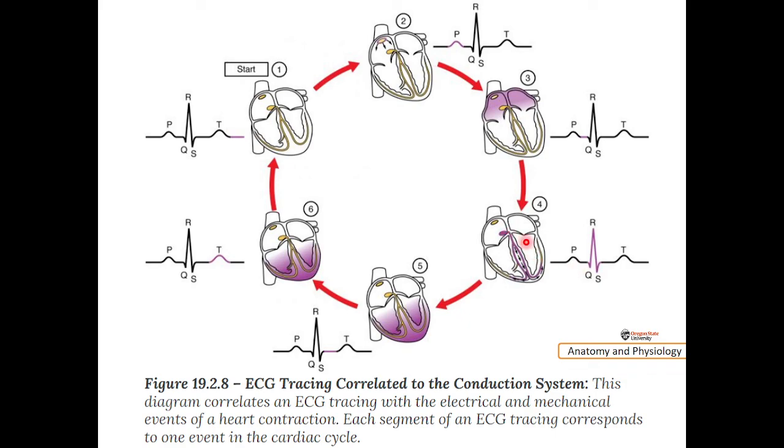After that comes the QRS complex. The wave of depolarization will come here, away from the... it's in the direction of the cardiac axis, the direction toward the positive. What will happen is this large R wave will be produced. And what about Q?